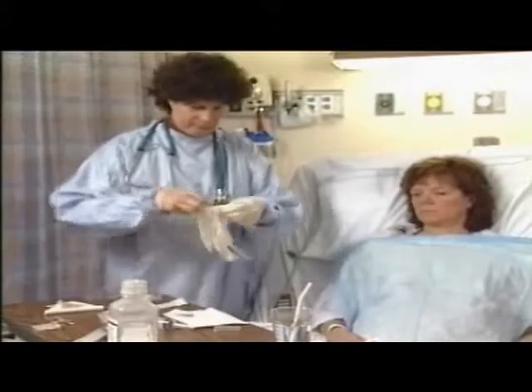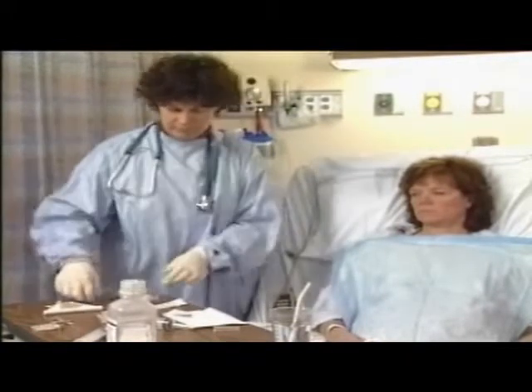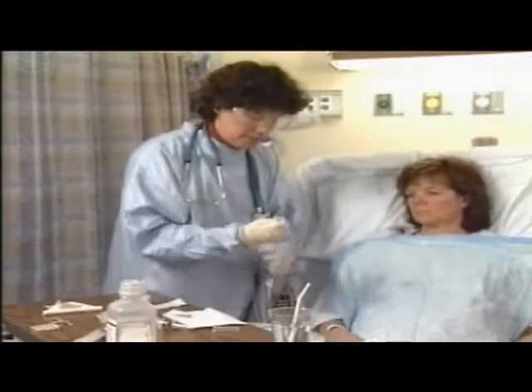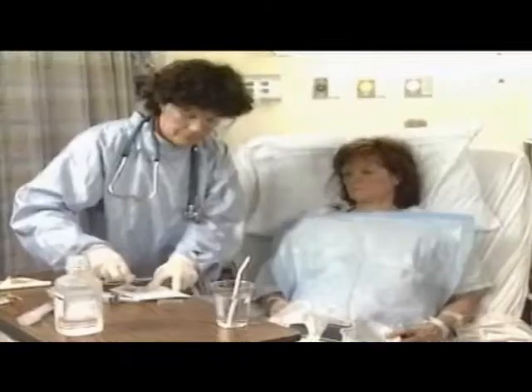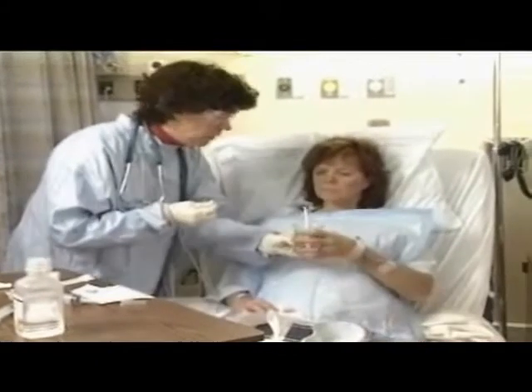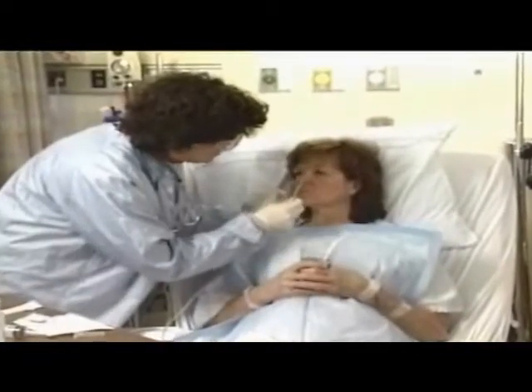Don protective equipment at this time. Curl four to six inches of the tube and release to facilitate the downward curve of the nasal pharynx. Lubricate the end of the tube with a water-soluble lubricant. Remind the patient of the distress signal before proceeding.